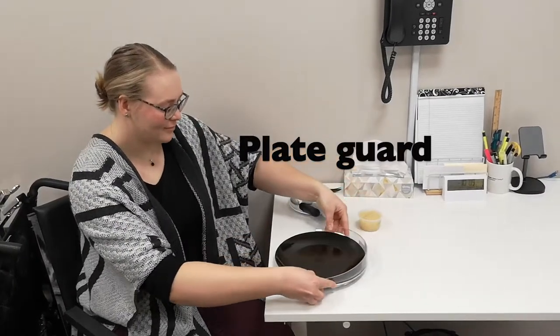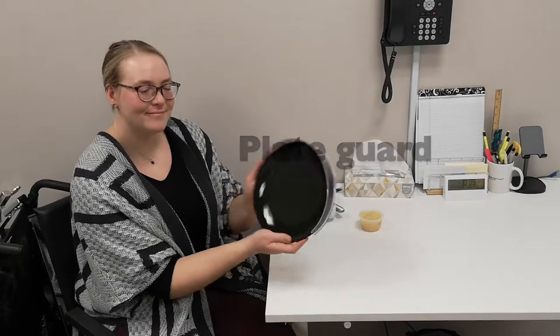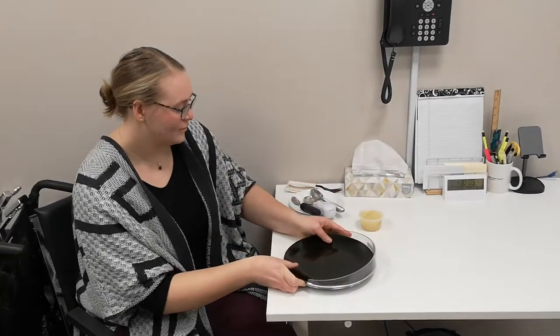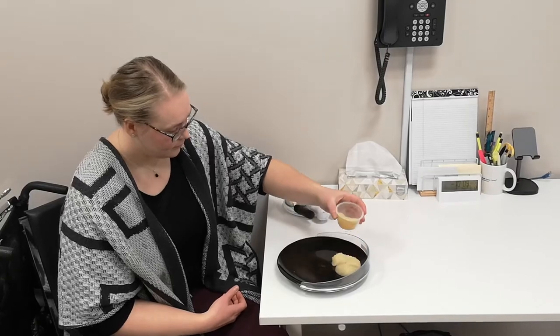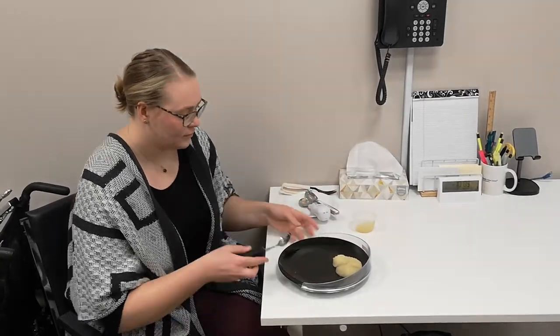A plate guard can be easily attached and detached from round plates and is used to prevent food from being pushed off the plate at mealtime. Additionally, it provides a steady surface to make scooping food easier.